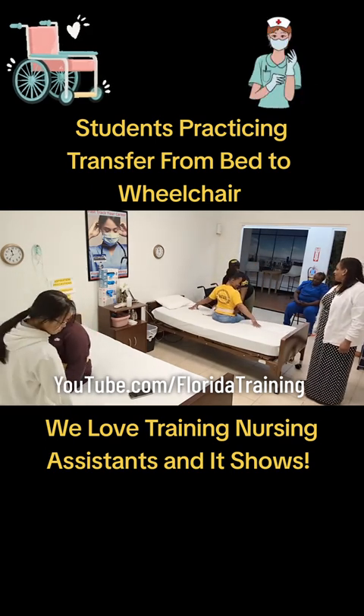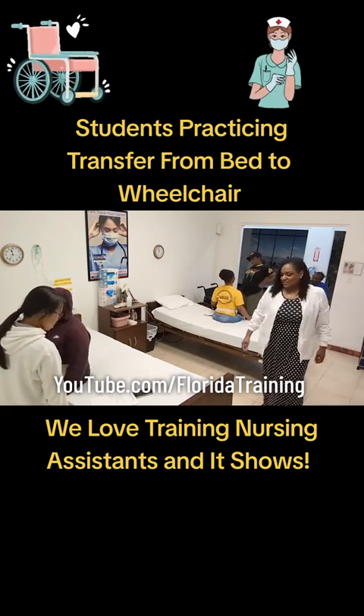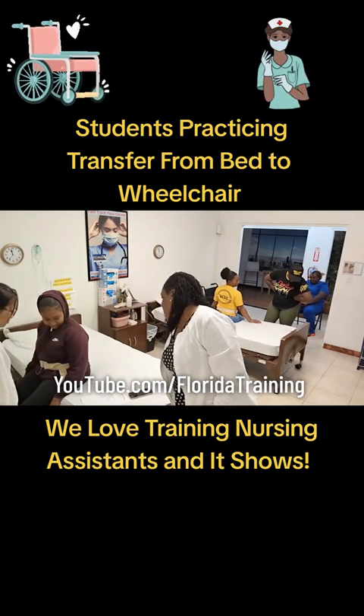You aren't ready to transfer to the wheelchair yet. Your wheelchair's not right — put it back and read your notes. Feet are flat on the floor, apply the belt. How should the wheelchair be?